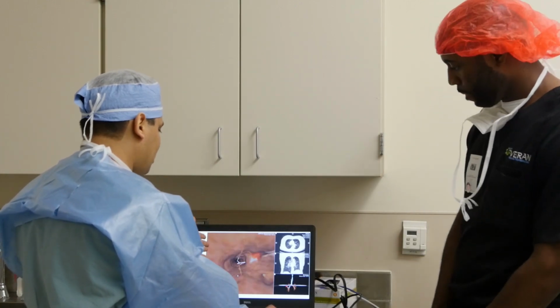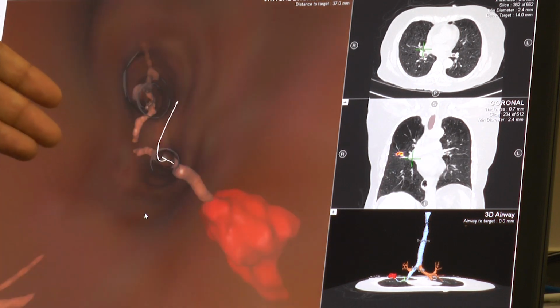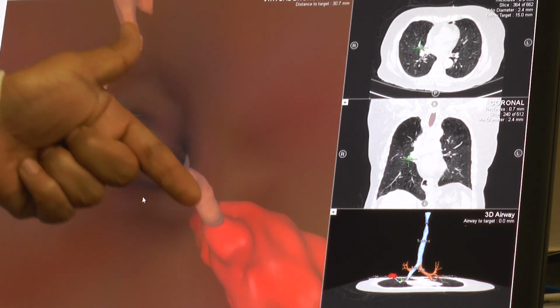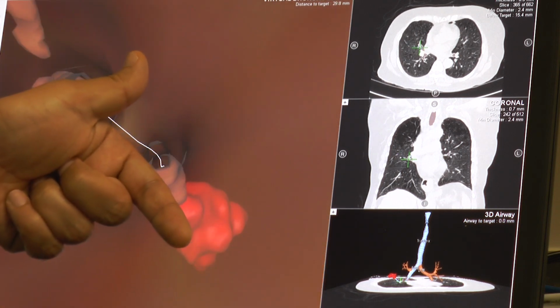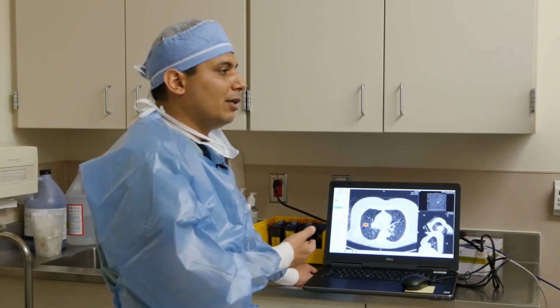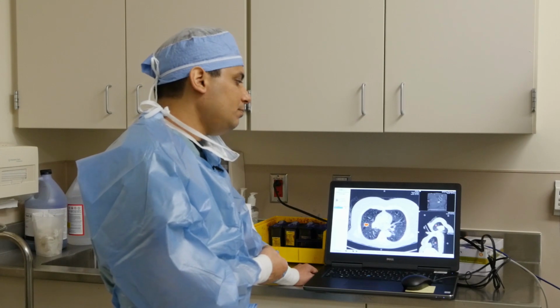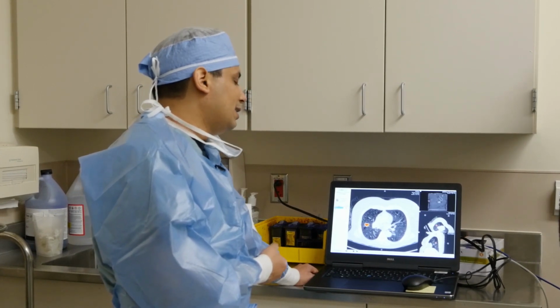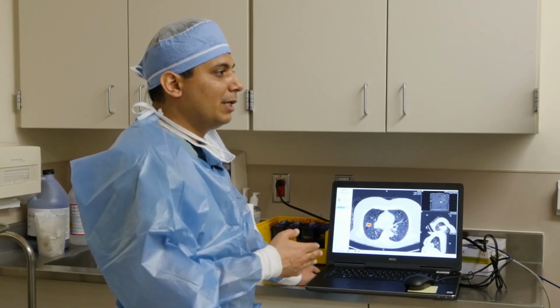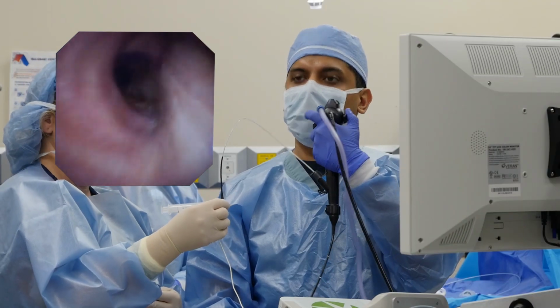So we'll be in the right main bronchus, bronchus intermedius here, right middle lobe bronchus, going into the lateral. So I think I will be able to get up until here. Now, this is going to be the difficult angle, like I was saying. But when I look at this scan, I think I would prefer making this diagnosis bronchoscopically because of her significant risk of pneumothorax. Right. And she's had 2 navigational bronchoscopies before, but it was a different system, and I think we might have a better shot with this system. All right, so let's get to it.